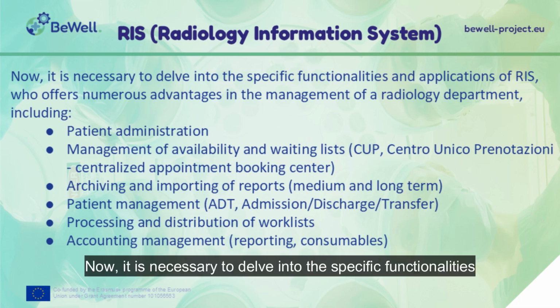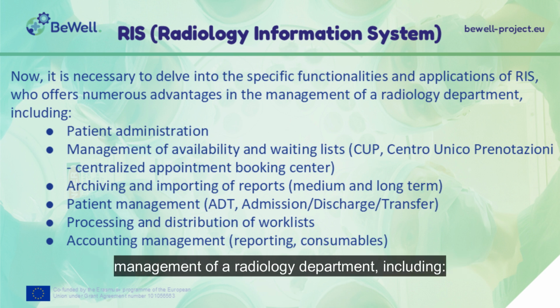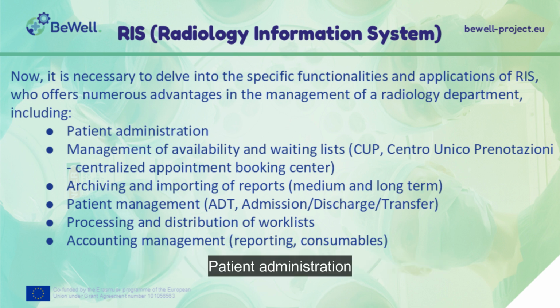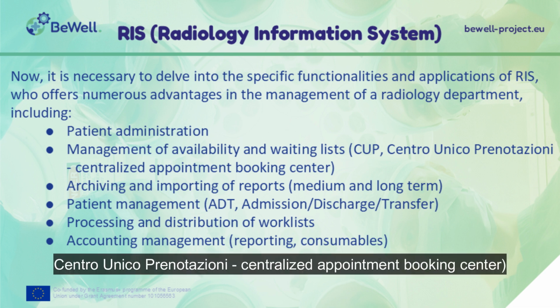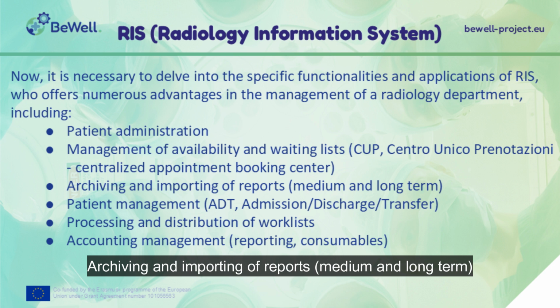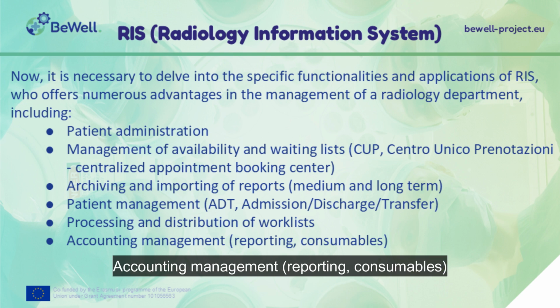Hello. Now, it is necessary to delve into the specific functionalities and applications of RIS, which offers numerous advantages in the management of a radiology department, including patient administration, management of availability and waiting lists, CUP, Centro Unico Prenotazione, Centralized Appointment Booking Center, archiving and importing of reports, medium and long term patient management, ADT, admission, discharge, transfer, processing and distribution of work lists, accounting management, reporting, consumables.